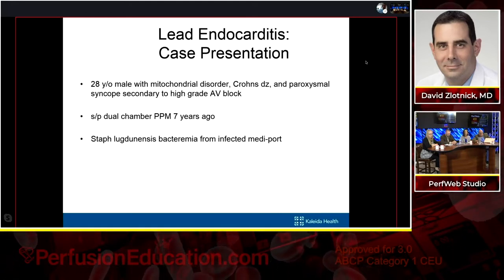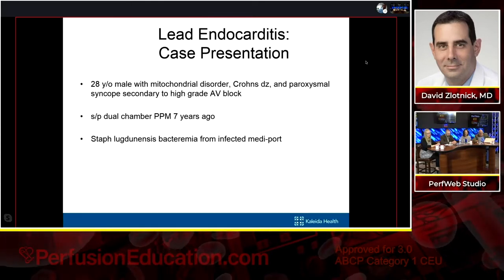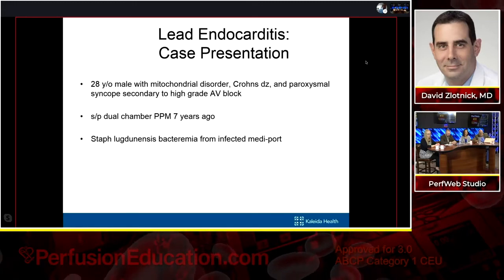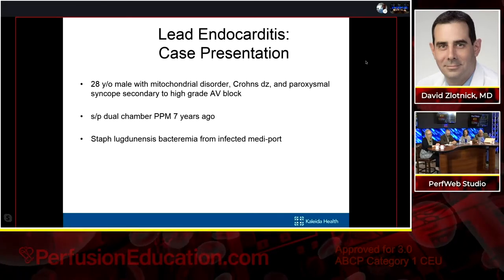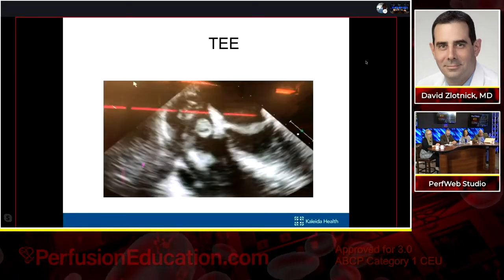and unfortunately, he was admitted to our hospital with a staph bacteremia. And what I'm going to do is show the TEE, and I'll point out, on this TEE, you'll see a large vegetative burden, not only on the pacemaker leads, but as well as a large vegetative burden on the right atrial wall, including a cystic structure. And you'll see that here.